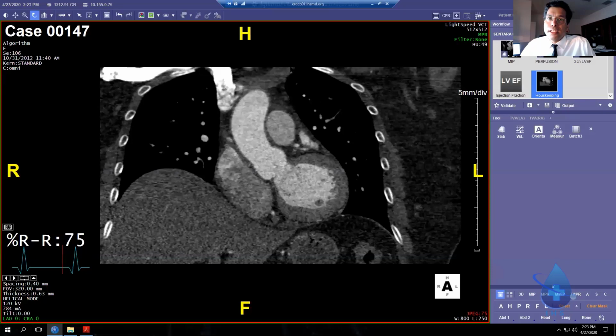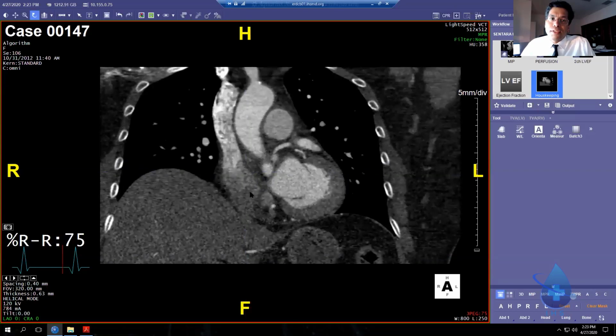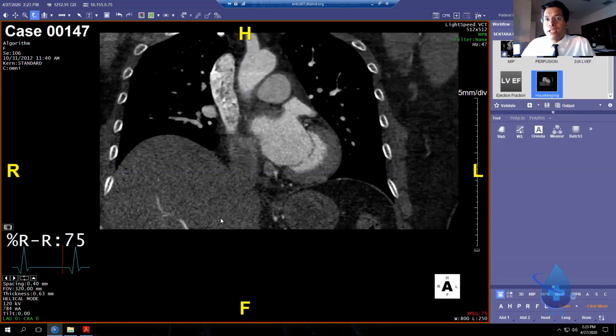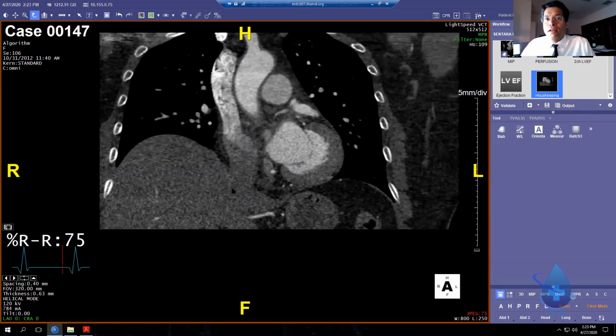This is the left subclavian vein, and together they form the SVC that comes into the right atrium. The IVC, we are not injecting contrast in a groin sheath in the right femoral, so there's usually not contrast coming in there. So this is about all the contrast that ever makes it down there into the IVC.